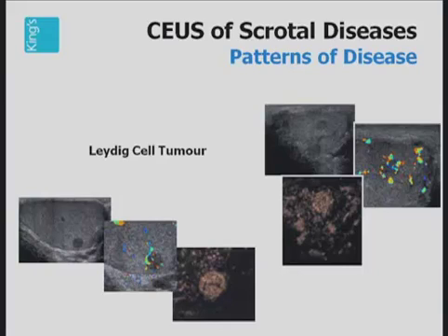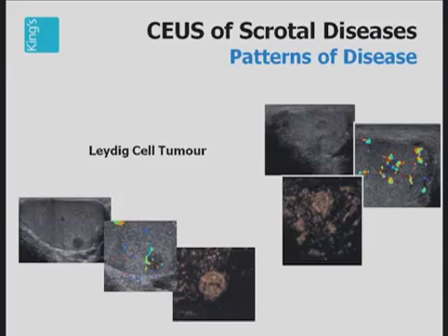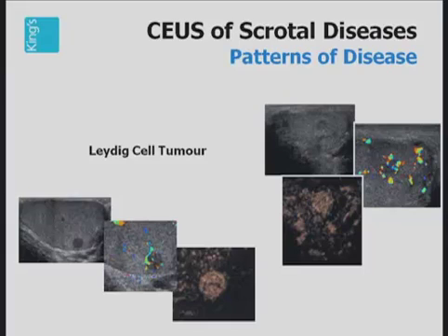For example, this is a Leydig cell tumor. Leydig cell tumors tend to be much more vascular than primary germ cell tumors, and the vascularity tends to last longer. However, this should not be used to differentiate this tumor from a primary germ cell tumor. In this case, it's important to ascertain that this incidentally discovered low-reflective abnormality in the testes is vascularized. This will allow appropriate management — either to watch the lesion over several months, or to allow surgical resection under ultrasound guidance.